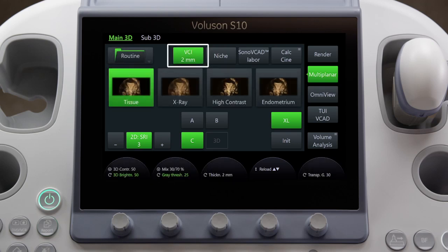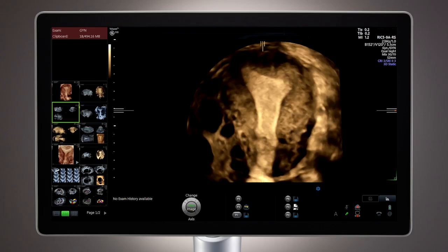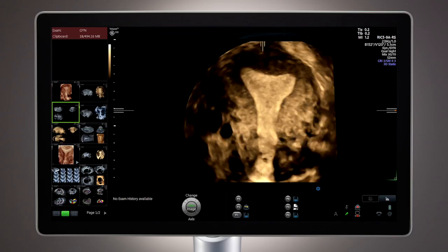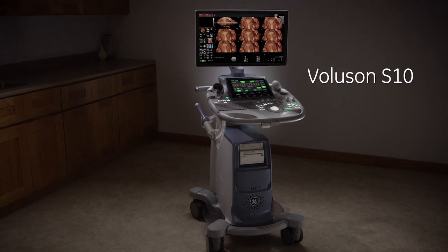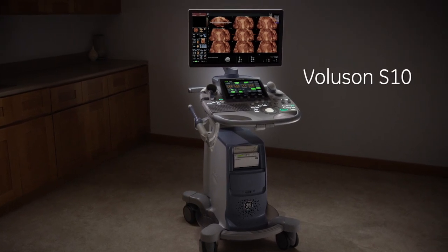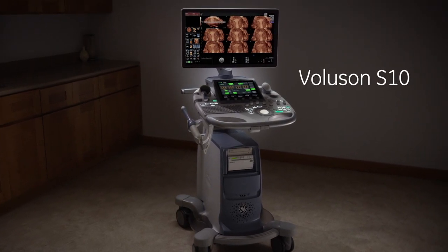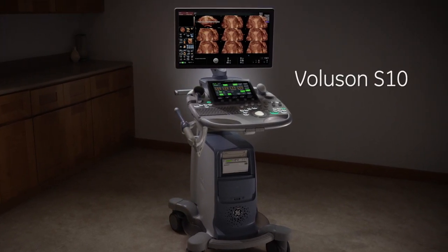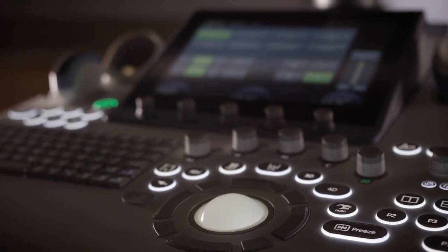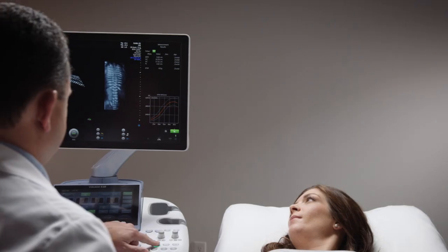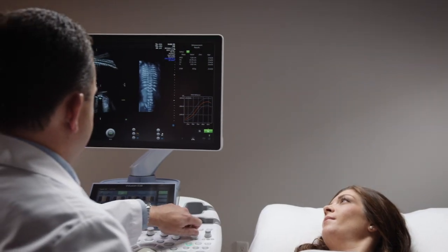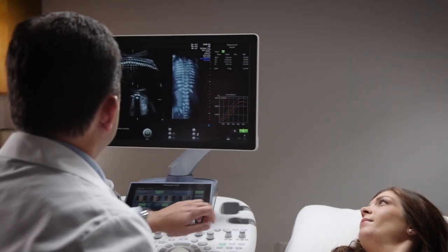VCI may be added for additional slice thickness and contrast resolution. The Voluson S10 offers exceptional image quality and advanced capabilities, all in an intuitive design, helping you to make clinical decisions with confidence.